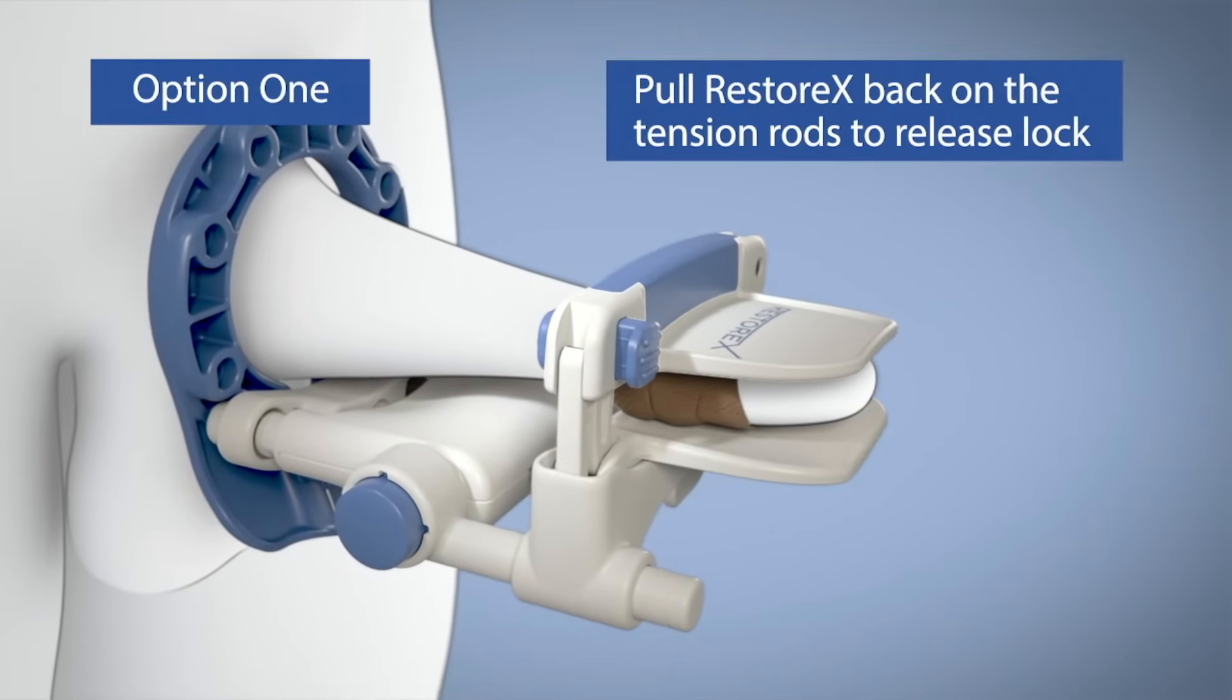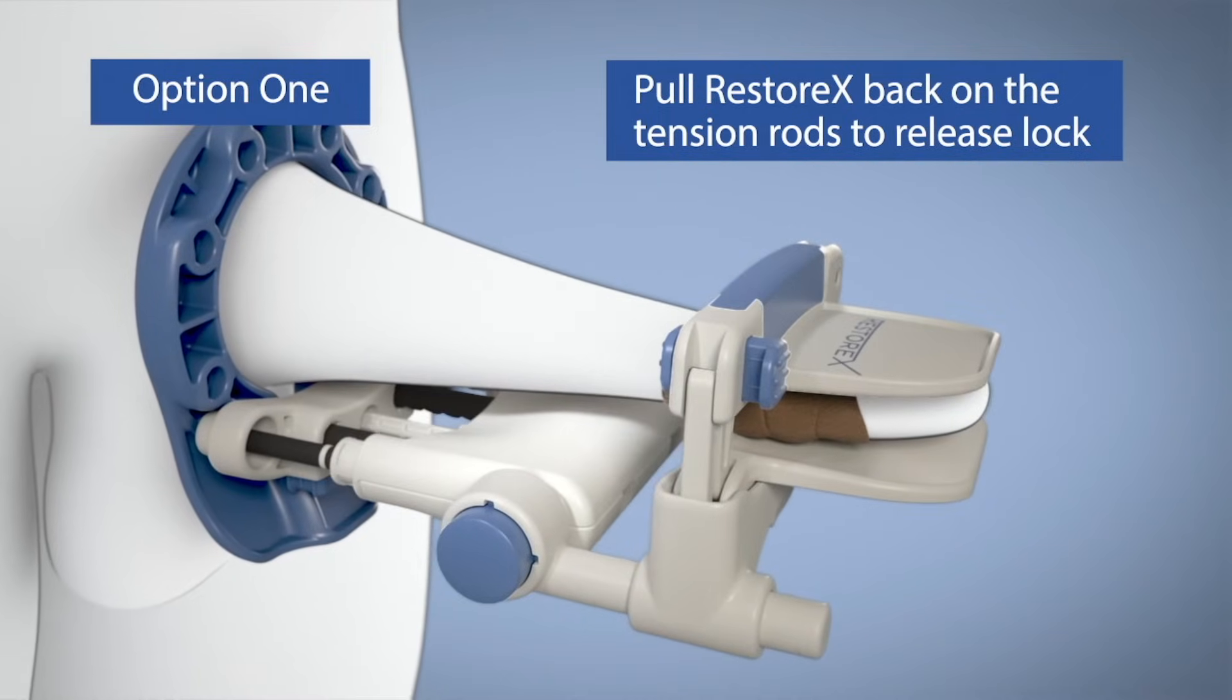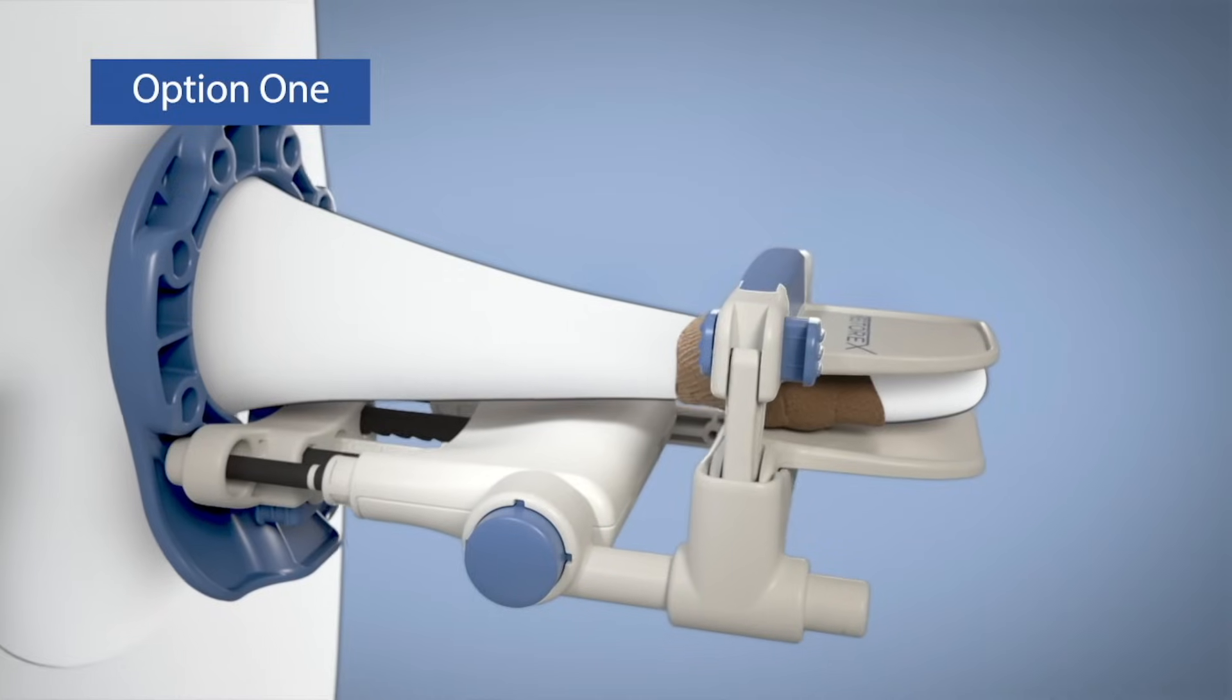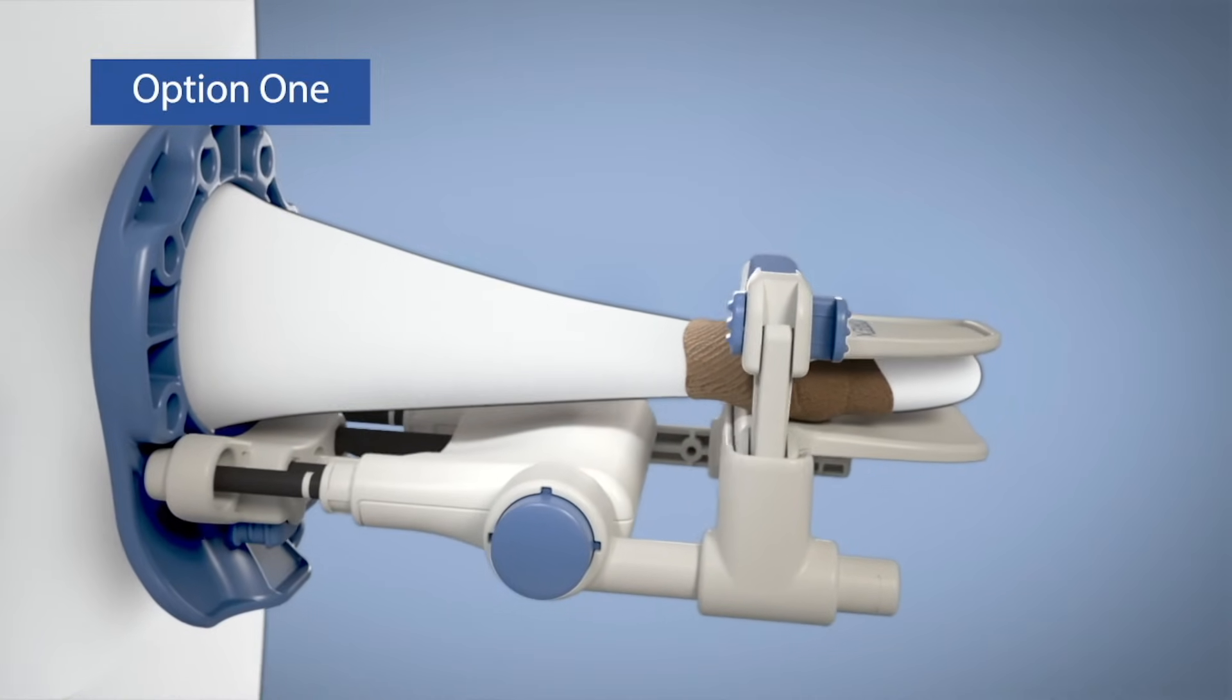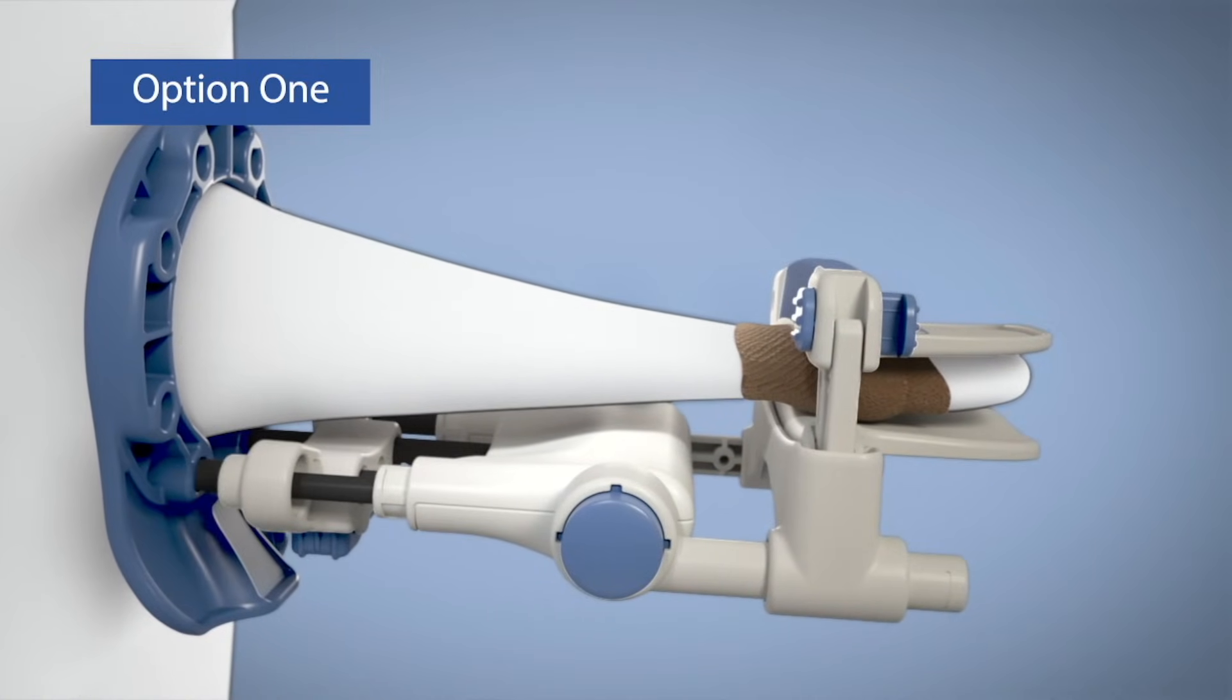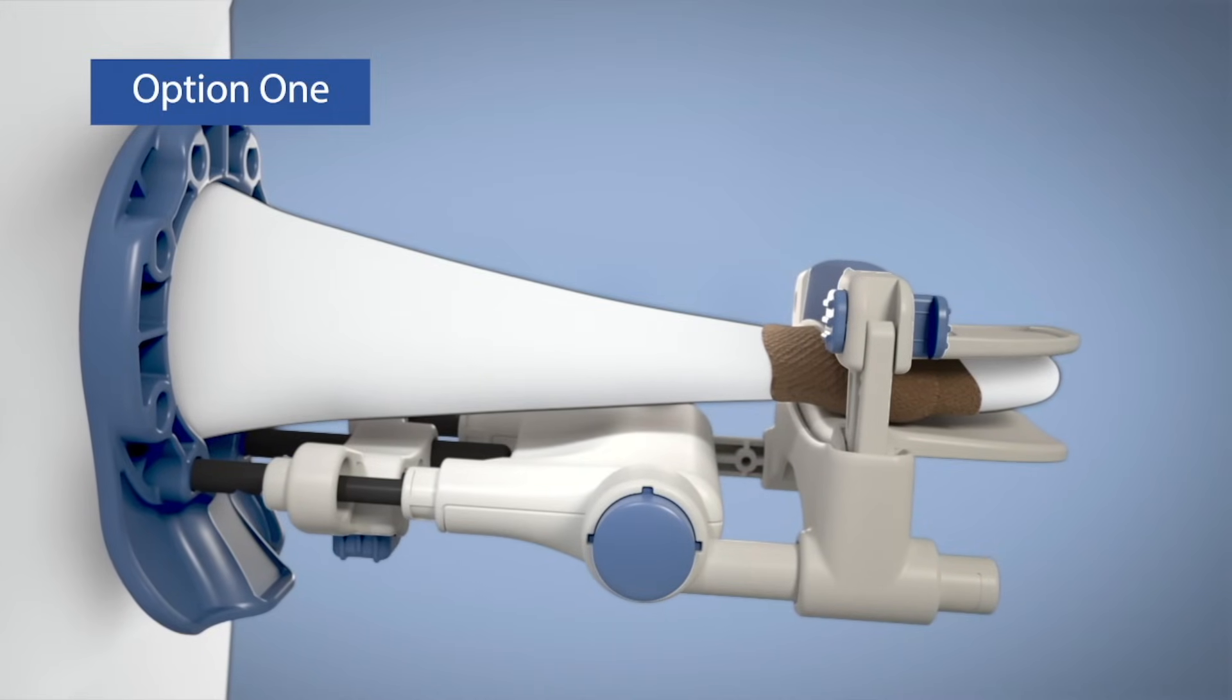Second, as shown, pull Restorex back on the tension rods to release the lock, and then slowly and gently release the springs. Next, while holding the pelvic ring against your body with one hand, lengthen Restorex by pushing it along the extension rods one notch at a time until the white bands on each tension rod can no longer be seen.